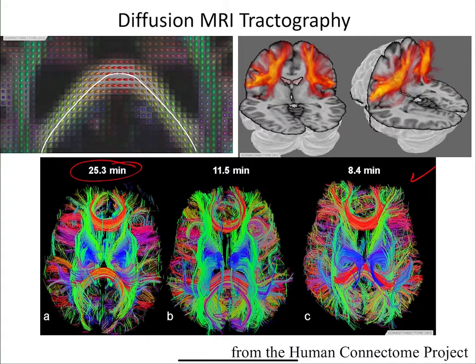But I think this is relatively remarkable in the sense that before DTI came along, there was really no good way to do this, even in cadavers, right? Because even in a cadaver, all you could do is put some agent in and follow it, maybe one fiber, but then you'd have to do it over and over again for every little fiber. So even if you could take someone's brain out and freeze it, it'd still be really difficult to do this. Okay.